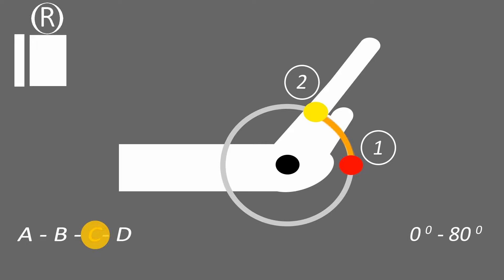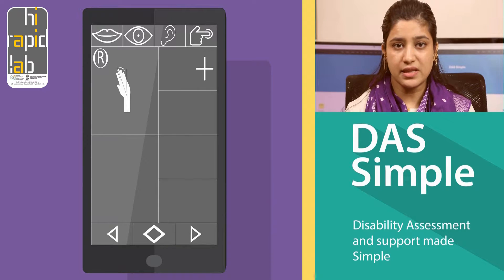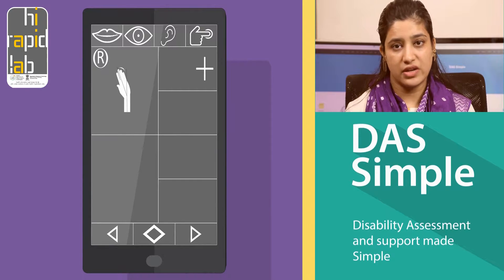The center black dot of Argon should be positioned on the lateral aspect of the wrist joint just distal to the radial styloid in the anatomical snuff box. The red dot should be positioned parallel to the radius, and slide the yellow dot parallel to the metacarpal of the little finger as shown in the image. The angle will be automatically displayed, and when you click save or next it will be automatically captured in the database. The next test screen then opens.